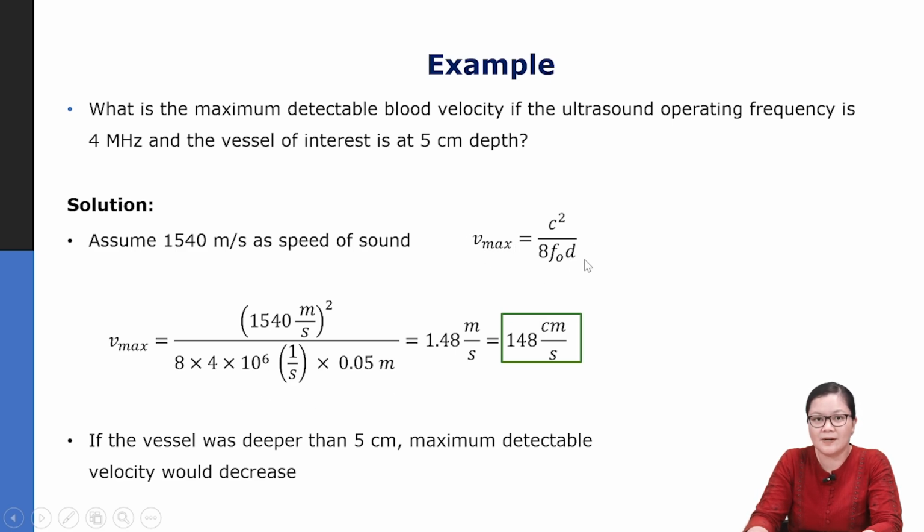The deeper your depth window is, the lower the maximum velocity, and vice versa. This can happen anywhere in the body, for example the heart, where cosine of a 0 Doppler angle is 1. If you image the heart, the blood flow can be in various directions, so depending on your image field of view, the Doppler angle can even go to 0 degrees.